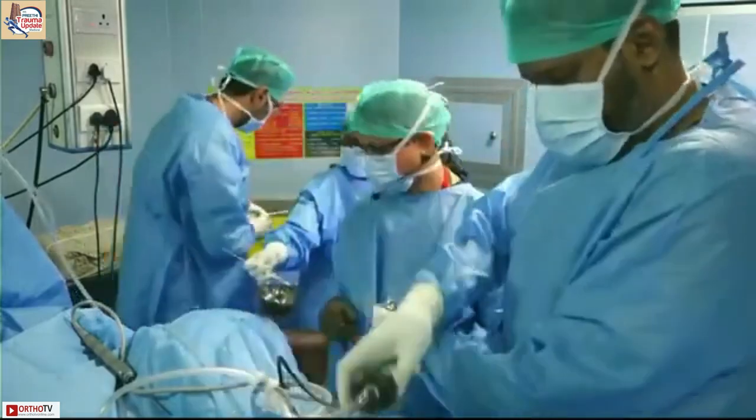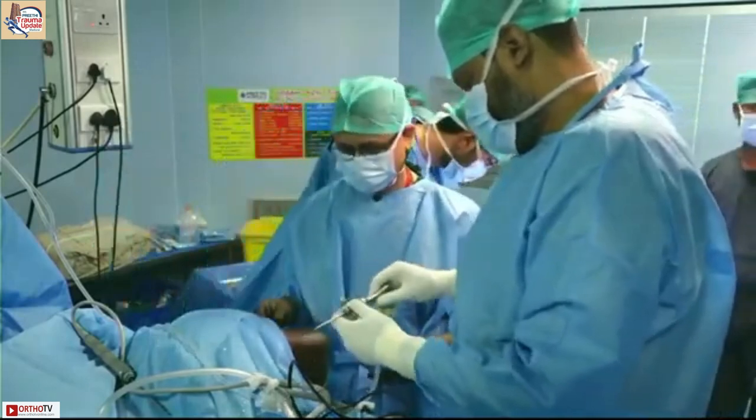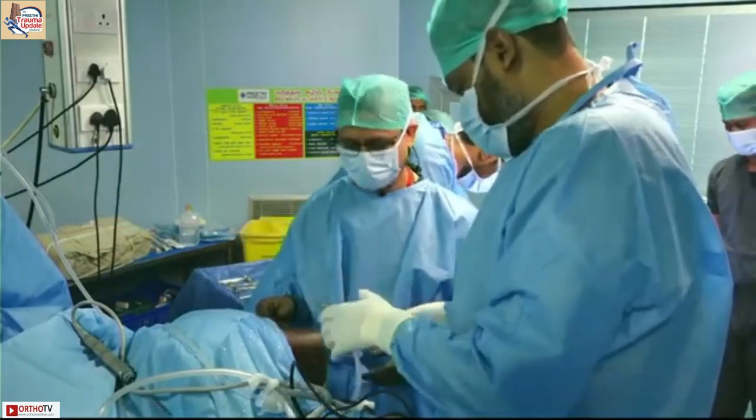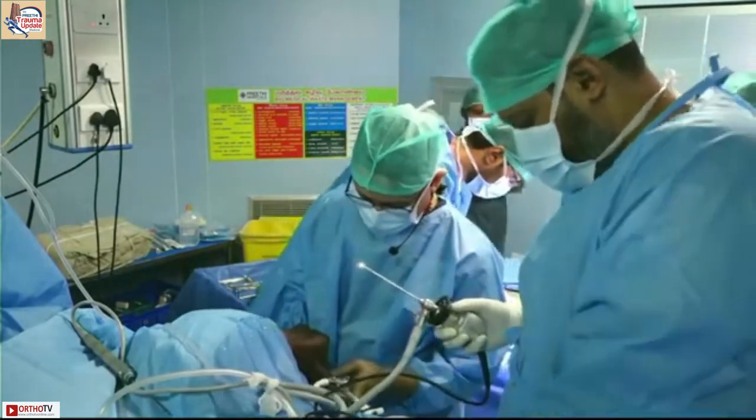So if you remove the body, I'll show you. It often happens that the scope comes out when you pull the body a little hard. And then it's a task.